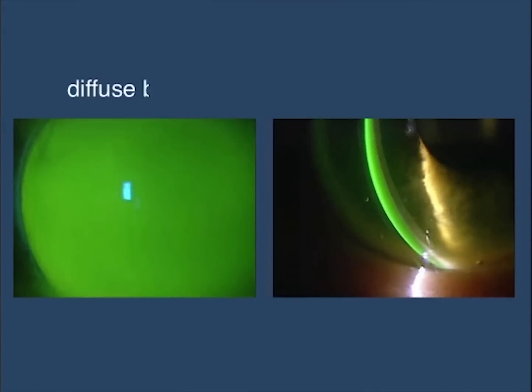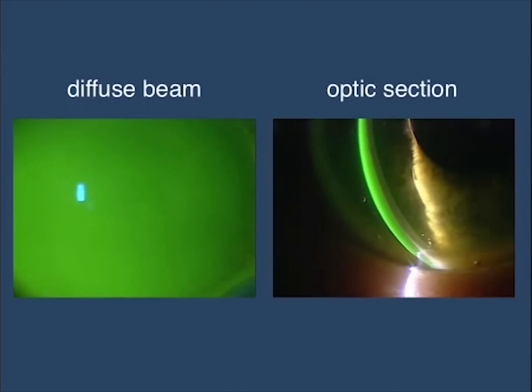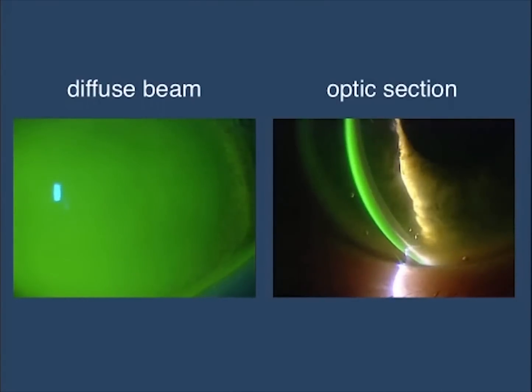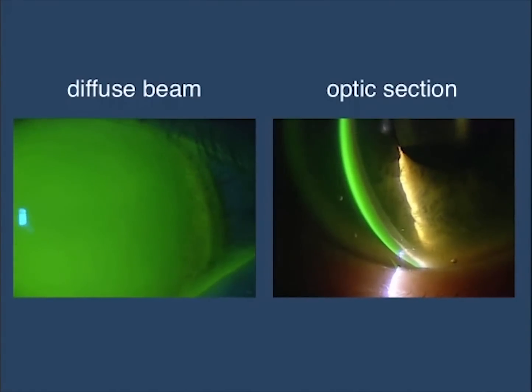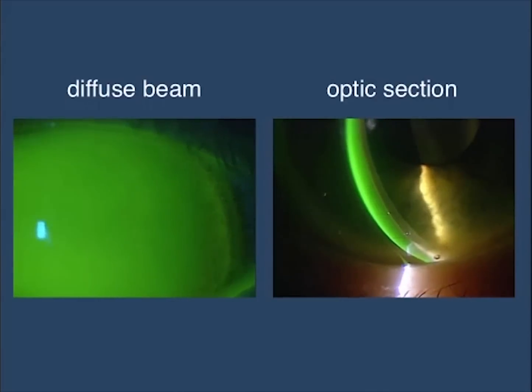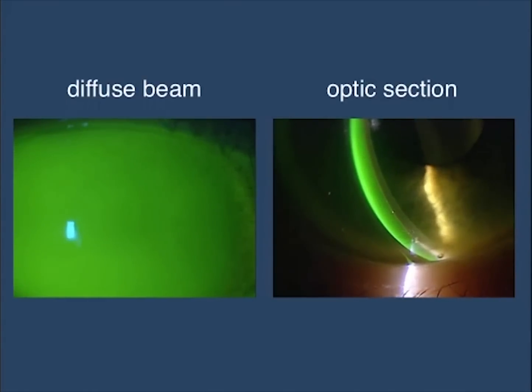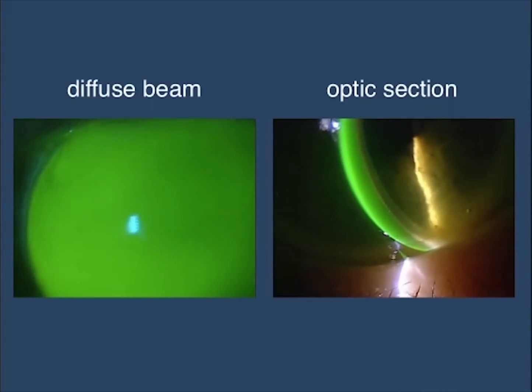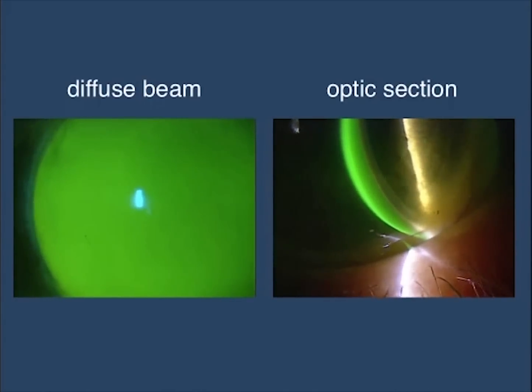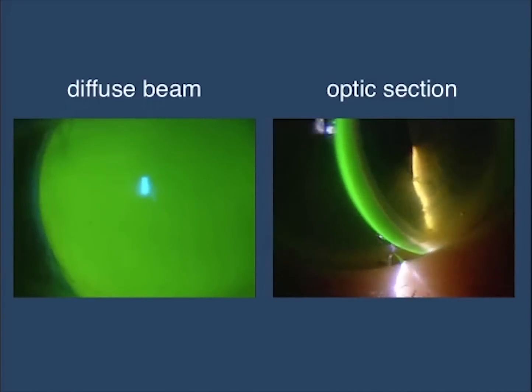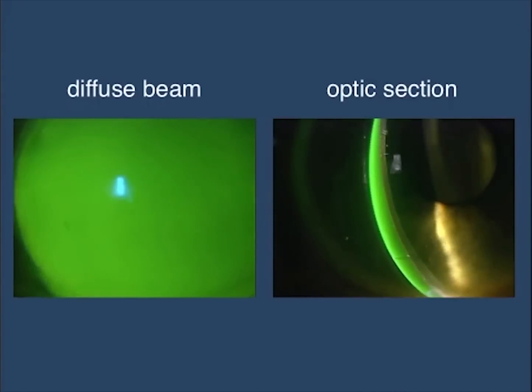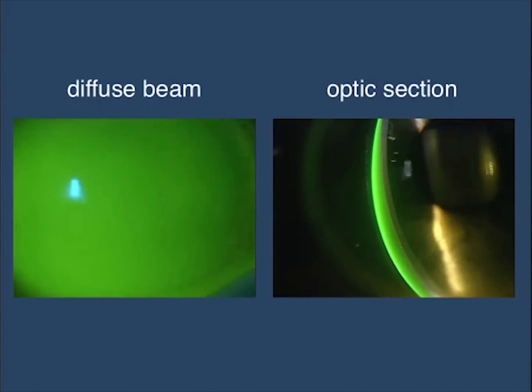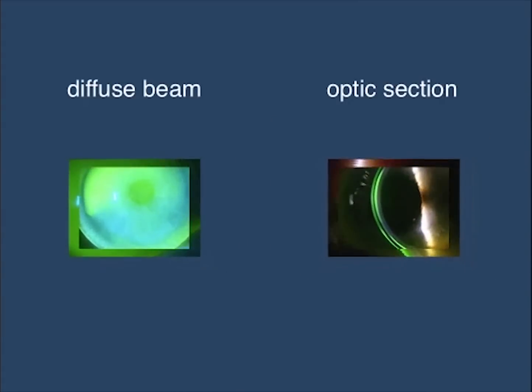This is an example of a scleral lens with significant clearance. As you can see, the fluorescein is greater than three times the thickness of the lens. In order to decrease the clearance, the sagittal depth has to be decreased. You can flatten the central curve or flatten the limbal curves — either or both of these strategies would be effective in decreasing the sagittal depth and thus the corneal clearance.